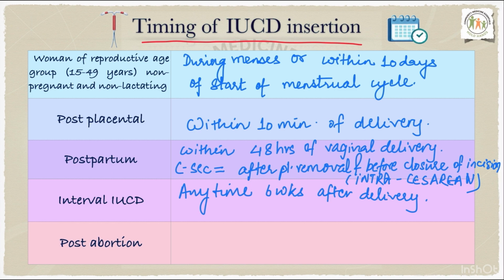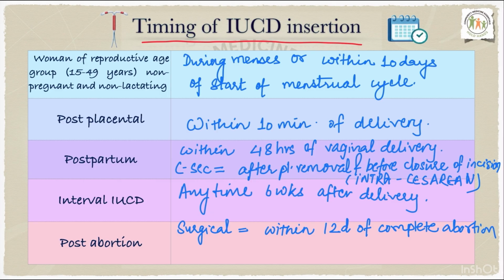Post-abortion insertion: if surgical abortion was done, then within 12 days of complete abortion. If medical abortion, then around day 15 of complete medical abortion.